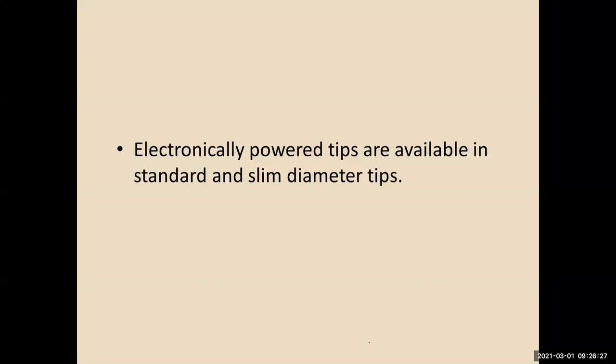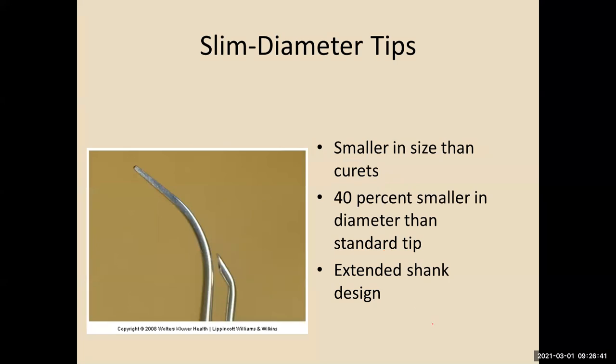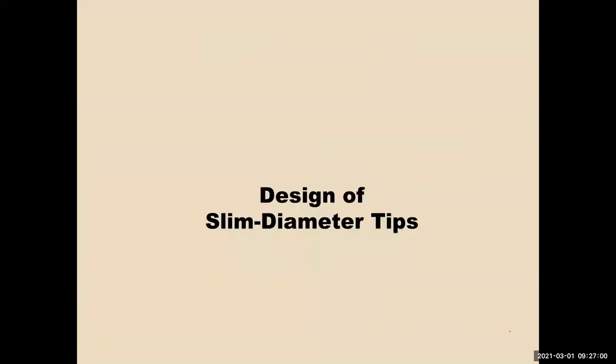So you've got inserts of all sorts of different types of diameters. The larger the diameter, the more calculus it is designed to remove. The slim lines are what we used to go into the lab to change into slim lines, but it's 40% smaller, just like your mini curettes. It's made for lighter deposits, but you can get into tighter areas, deeper pockets.